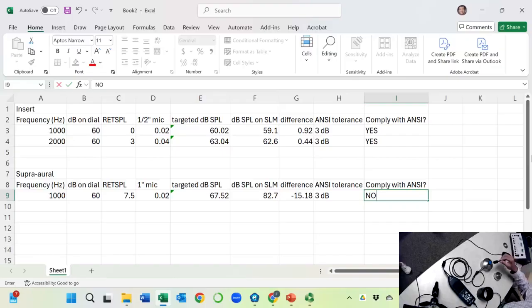Now we can put the bone vibrator on it, make sure it's roughly centered, and then put the guard on it. Make sure it's centered, and then put the weight on it. This time we need the ring, so that the total weight is now 550 grams.